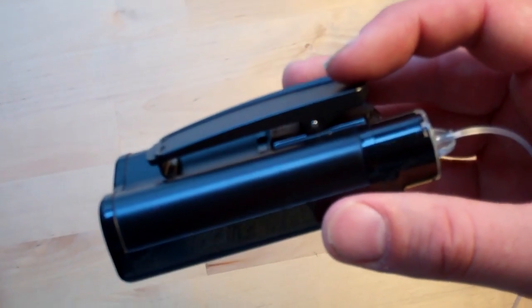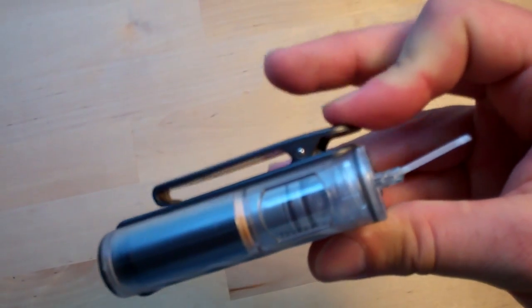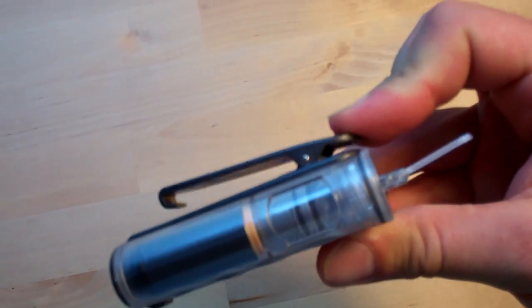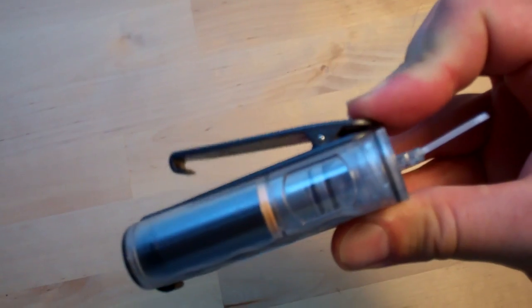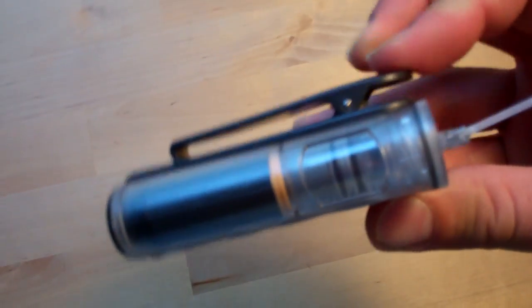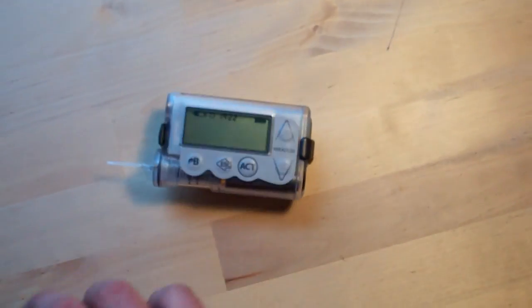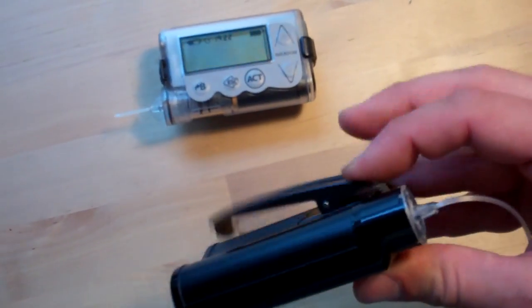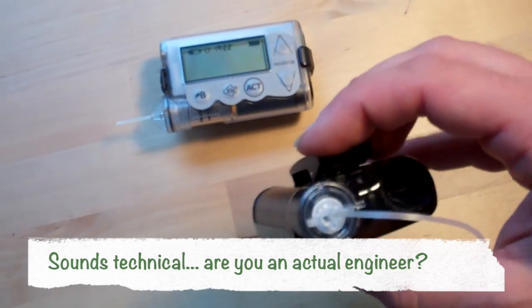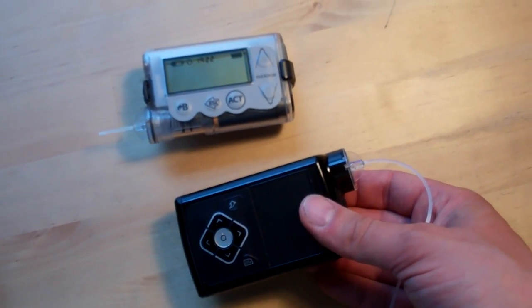The belt clip on the 640G is quite similar in a lot of ways to the belt clip on the Veo. But the spring on the Veo has a lot more spring — it's a lot springier. So what you end up with is a pump that's slightly bigger and slightly heavier being held by a much more flippy-floppy spring, and occasionally I find that a bit of a problem.